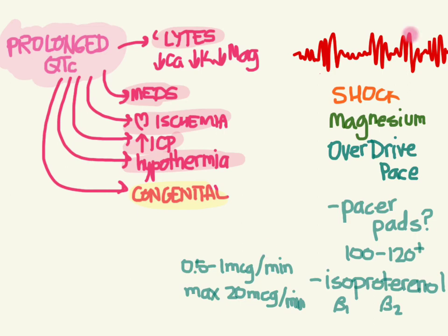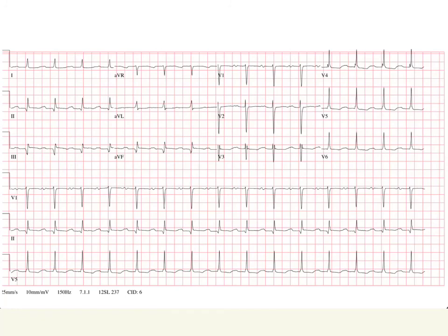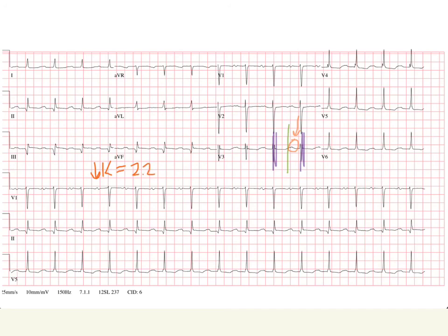Now if at this point they're still in torsade, you'd call your electrophysiologist and see if they need to put in a transvenous pacer. Let's actually look at an EKG with a prolonged QT. It's kind of small, but let me mark it out. Let's use the cheat method: put a line on the first R, the other R, and draw a line in the middle. See what side the T falls on — and look at that, it falls on the wrong side. So that's an elevated QT. This patient had actually presented with hypokalemia — the potassium was around 2.2. The treatment is to fix the cause, so you'd give them potassium. And we know hypokalemia is often accompanied by hypomagnesemia, so give them some mag too, which will also be protective against any torsade that might happen.